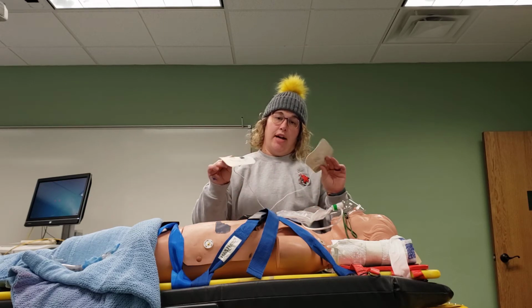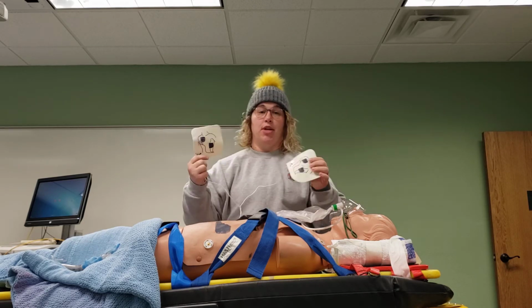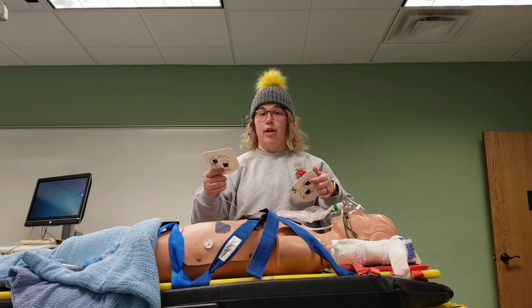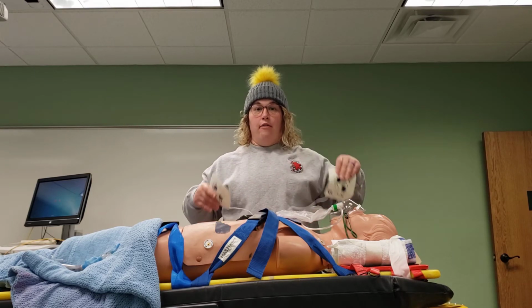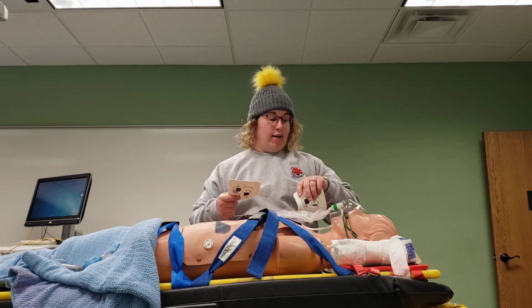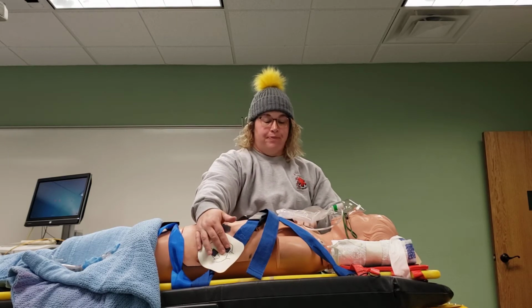So one of the things that I see, and the reason why I provided these pads to you, is people will put these on wrong, especially at the EMT level, or on a cardiac arrest with a newer EMT. Adrenaline's running and they panic. So I've seen every iteration of the wrong way of putting these on. So what I encourage you to do is just to practice over and over again, looking at the pictures and placing it in that diagonal formation.